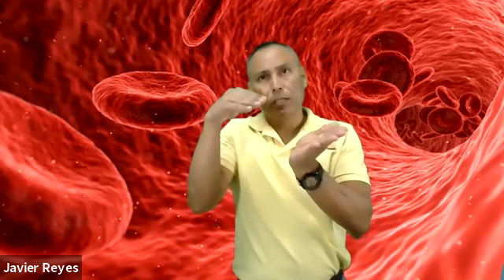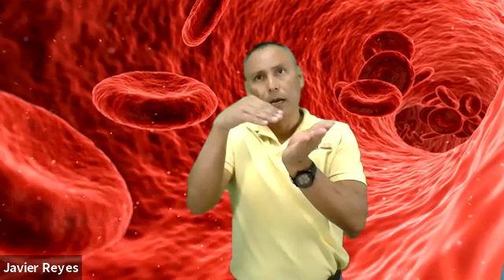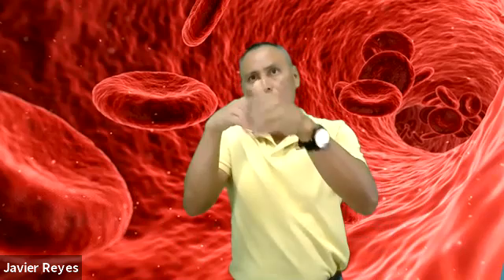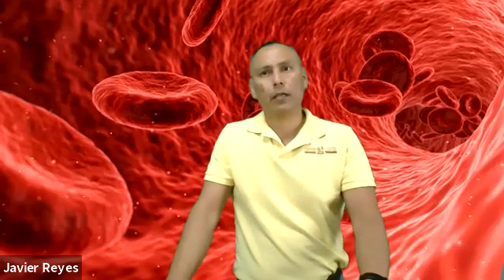If the bevel is only partially in the vein, it causes blood leakage into the tissue, so you start to see a little bit of blood coming under the skin. That's what could happen, right? Because you partially penetrated the vein, it's partially in, so the blood will seep out into the tissue, and you see bruising starting to form, or a hematoma.